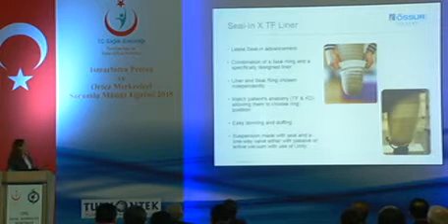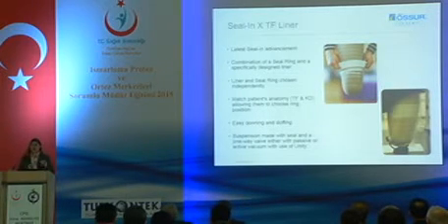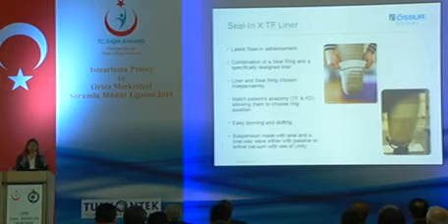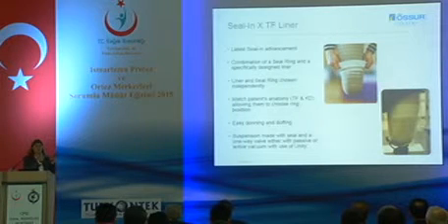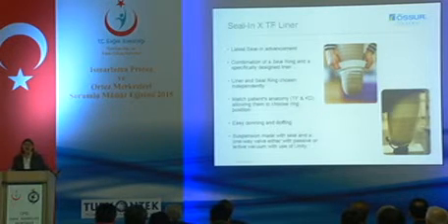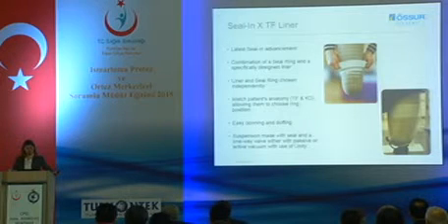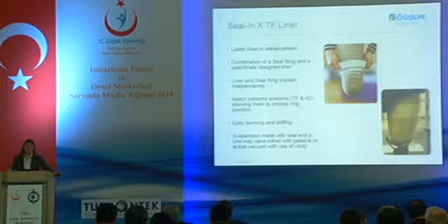Because the ring is separate, the liner is in fact like a very easy soft cushion liner, so it's very easy to put on for amputees. So before, when some patients, maybe because their hand function was limited, it's much easier for them to roll this on.